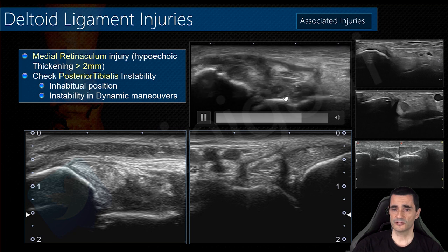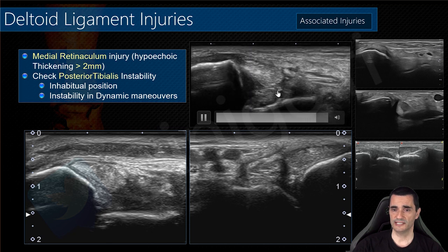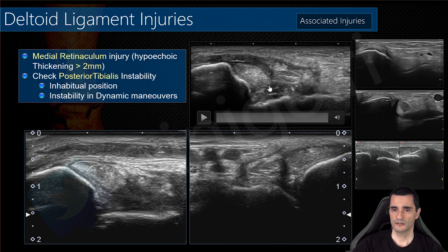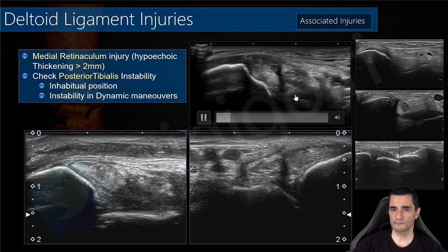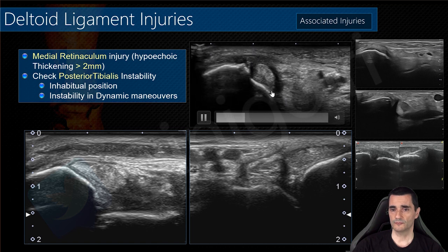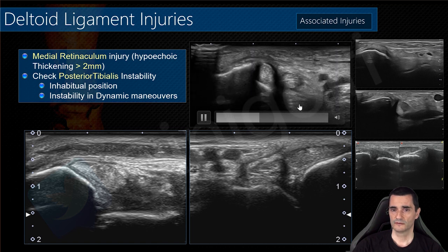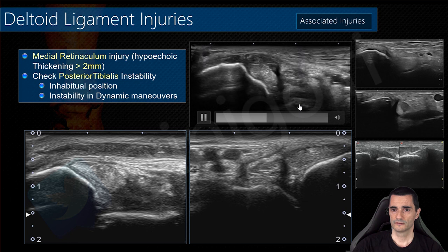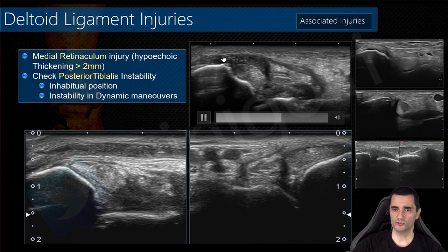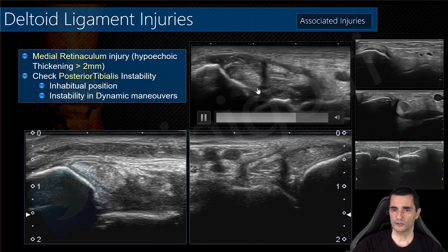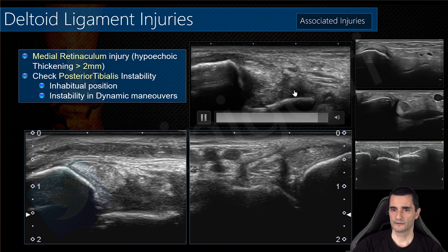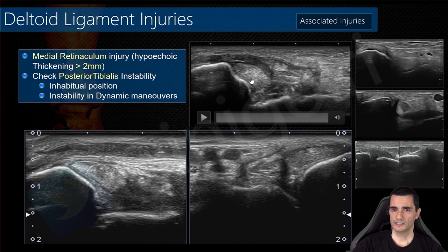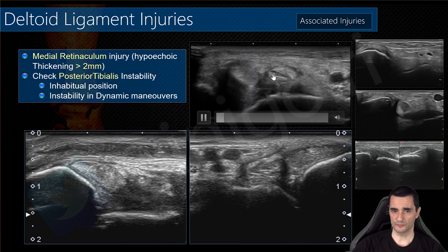Here you can see a large affection of the deltoid ligament — I believe the deep component of the posterior tibiotalar ligament has a complete rupture here. This image is to show the retinaculum affection and not the deltoid ligament specifically.